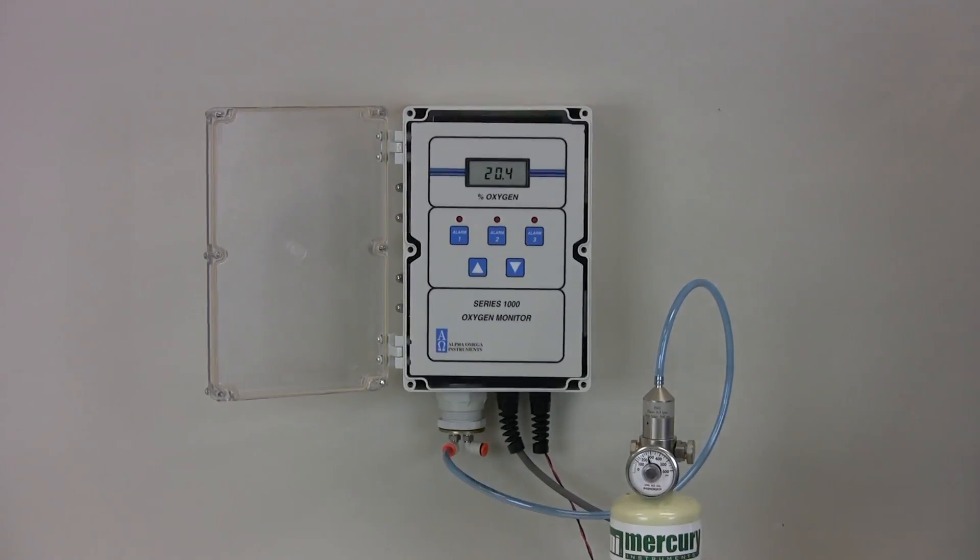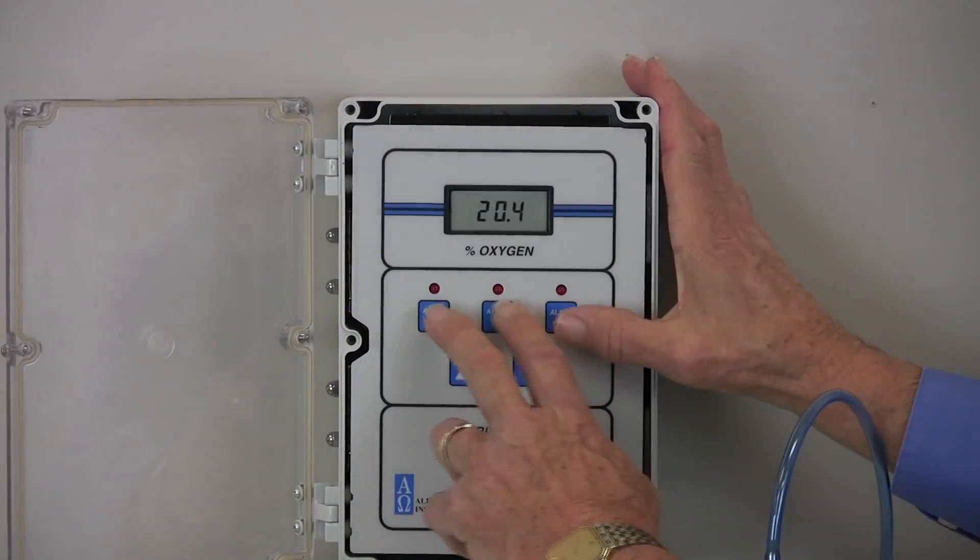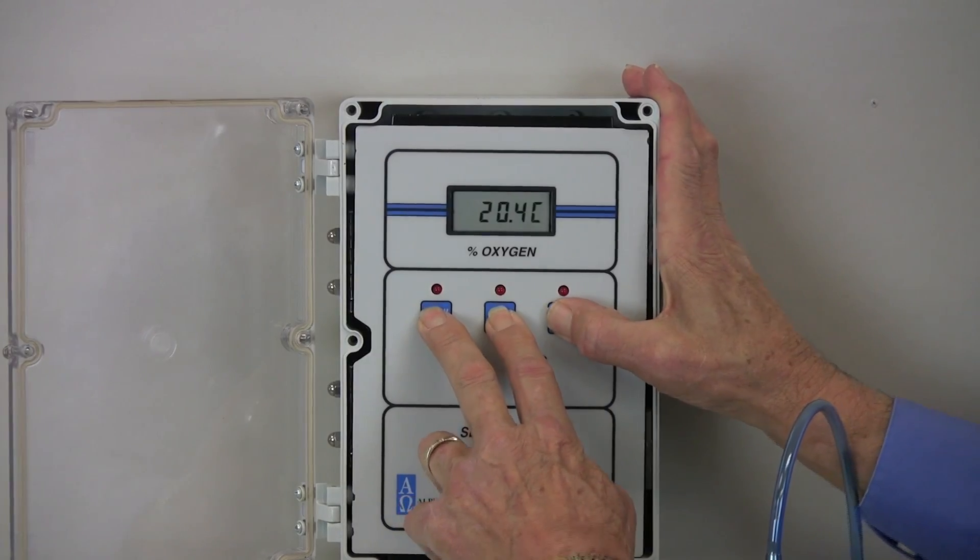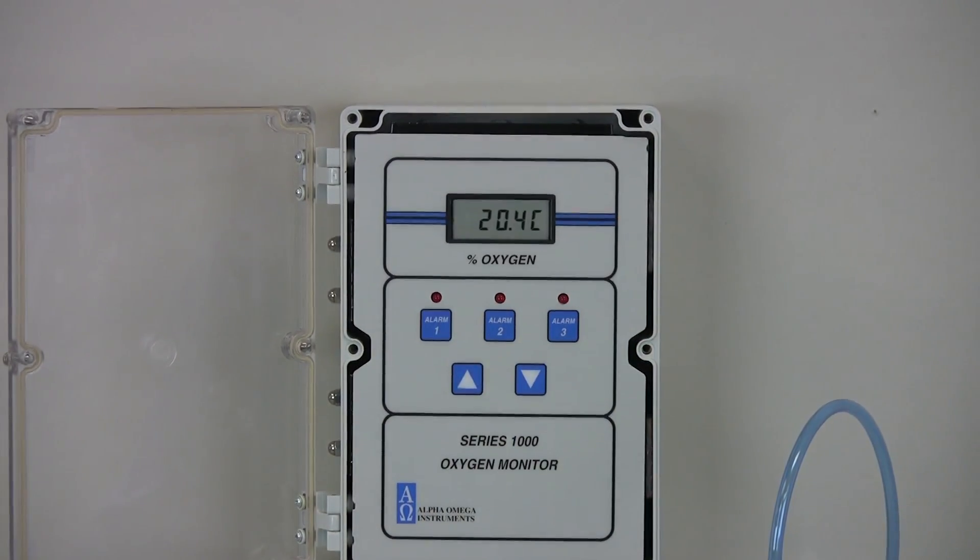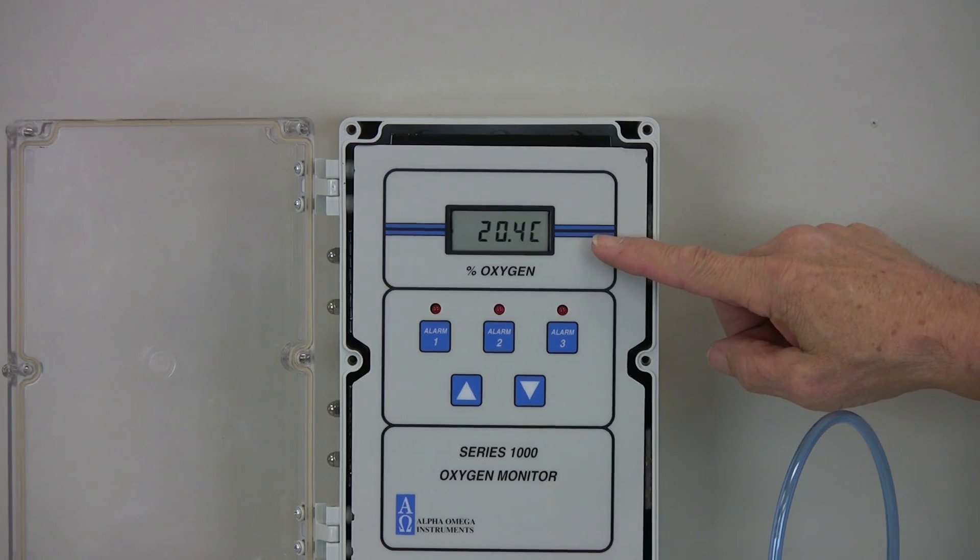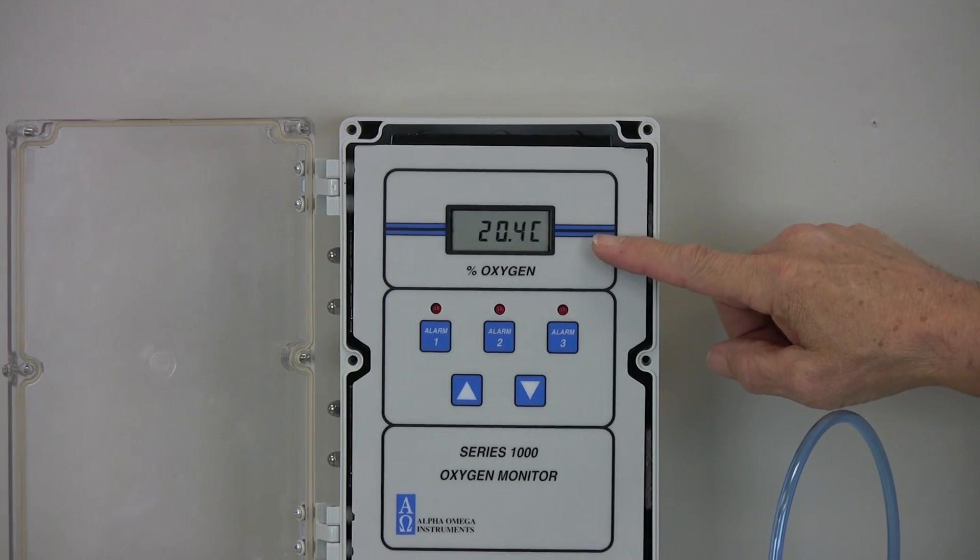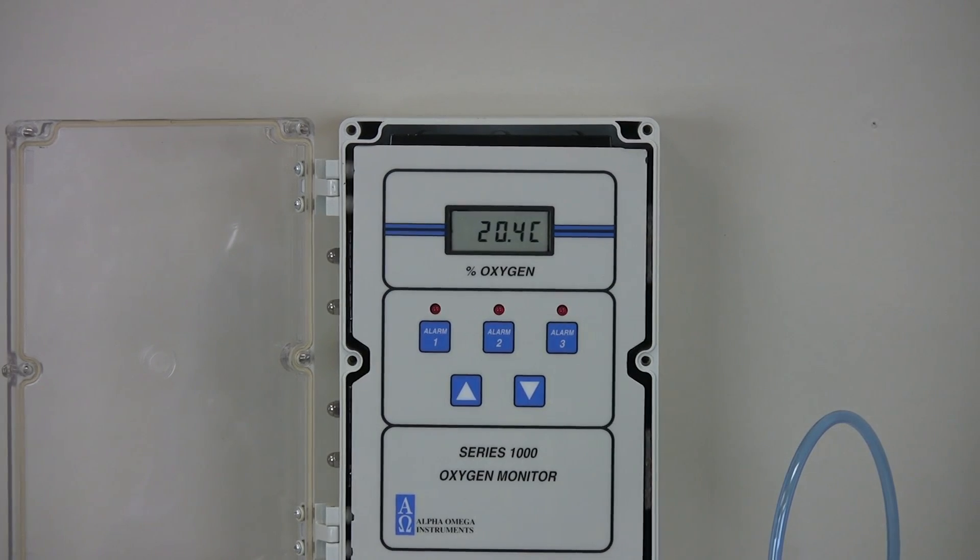To begin the process, first simultaneously press alarm buttons 1, 2, and 3. The digital readout display will continue to show the oxygen value and will add the letter C in the rightmost location of the display. This means that the instrument is in calibration mode.